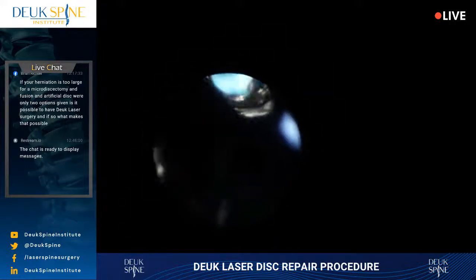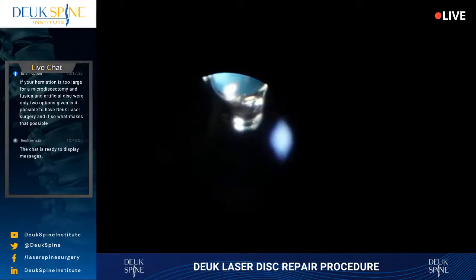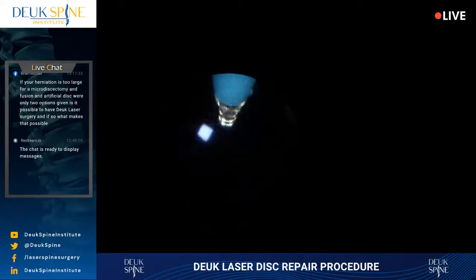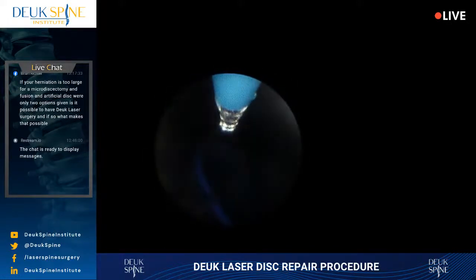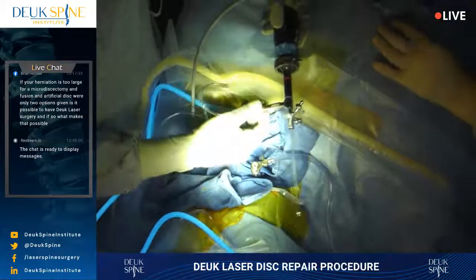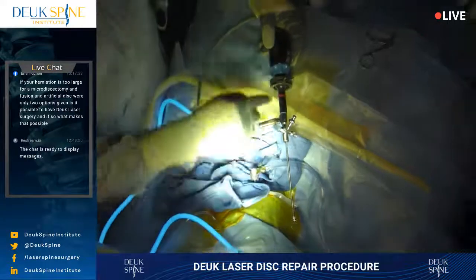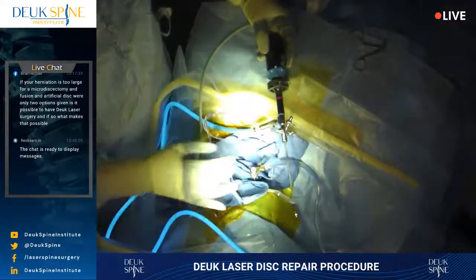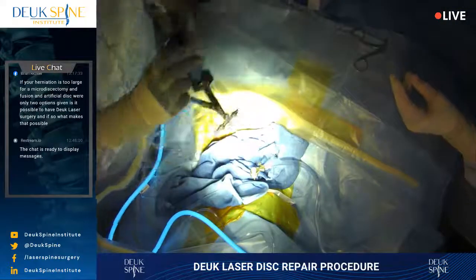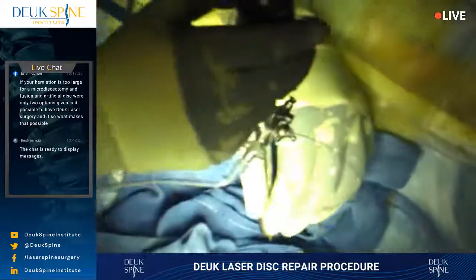All right, you want to show our viewers what's going on here, Diego? Show them the endoscope. Yeah, they're watching it. All right. You guys see this is the endoscope. We call it the endoscopic rig. And we've got irrigation, we've got a light source, camera, which is high definition. We have the actual endoscope, which is fiber optic, not rod lens. We've got 3 ports of access and a laser fiber going down the middle. Once again, I developed this technique.